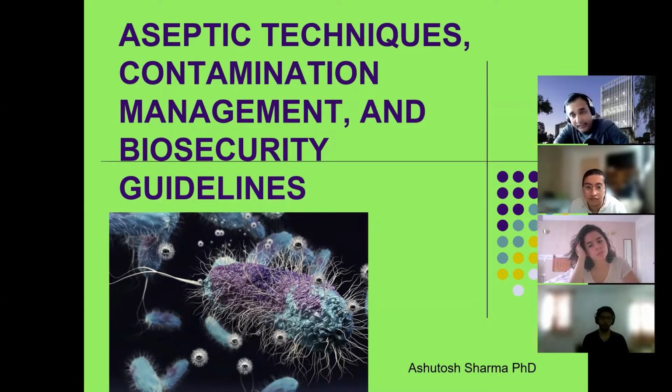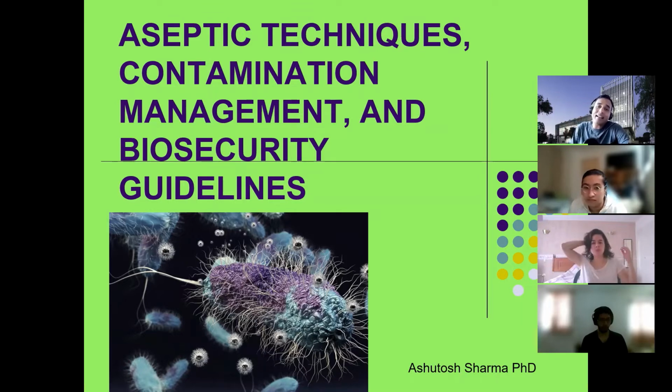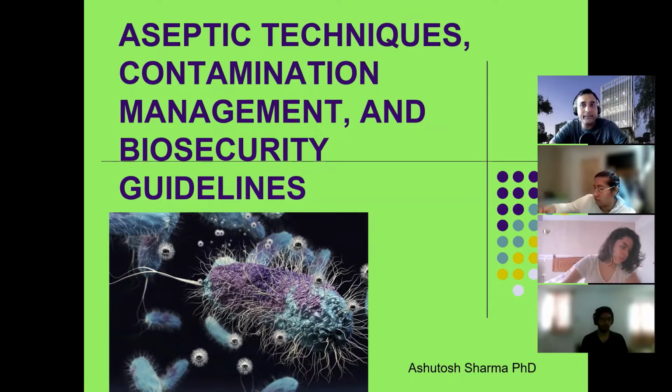Another thing is that there is contamination that comes from within the tissue, so you are not sterilizing it properly, right? So they are inside the tissue, and you will face that contamination within a few days, because the bacteria and fungi will grow quickly in the nutritive media. But 90% of contaminations are introduced by bad practices. It means you are not following the best practices in the lab.